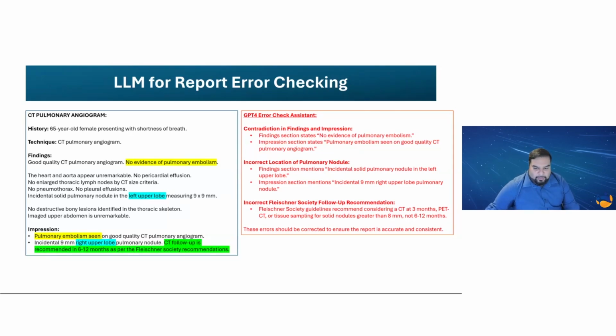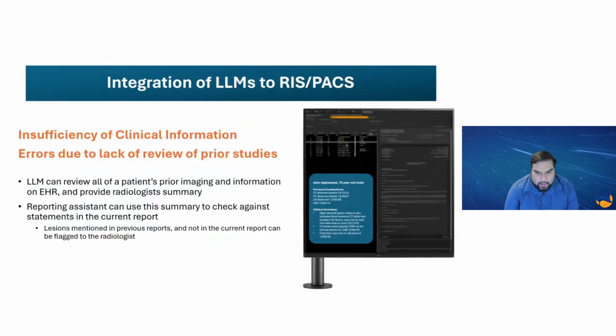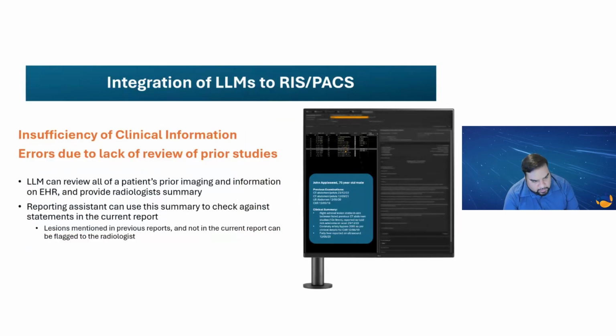Wouldn't it be great if every single report we had could be checked just before we signed it out with some sort of intelligent assistant like this? On a similar train of thought, the article I mentioned at the very beginning cited that insufficiency of clinical information and errors due to lack of prior studies was a significant cause of error.